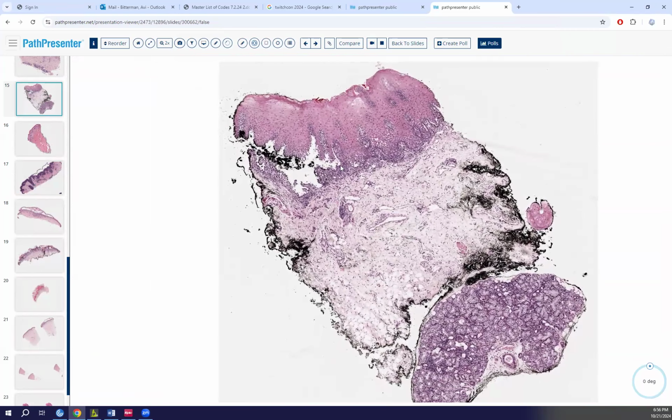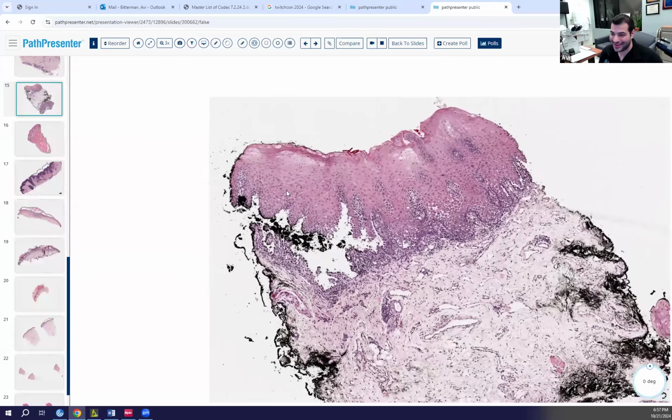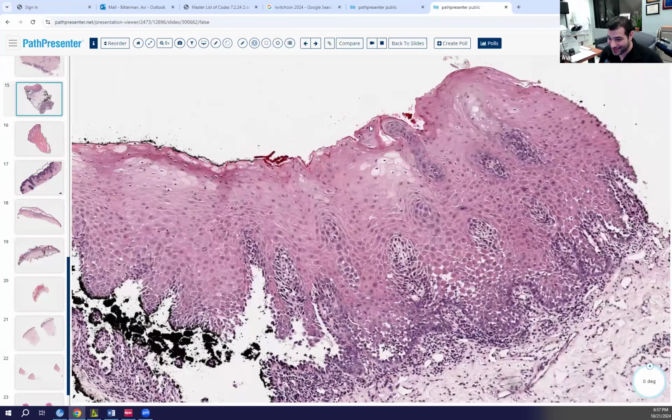No, it's cut just fine. I was thinking something like it's in the mouth, around the mouth, like a salivary gland or something. Okay, salivary. No, you're right. Salivary gland. Yes. And then what else are we missing here?